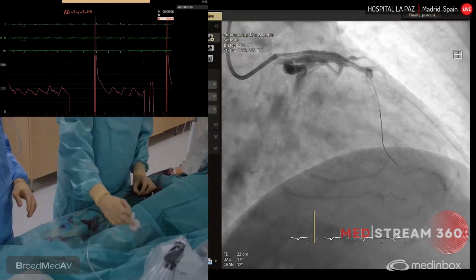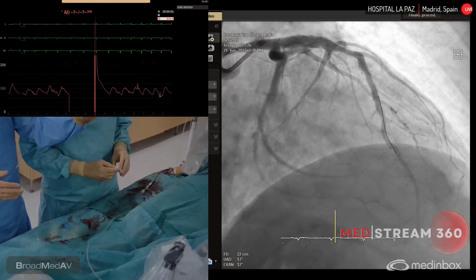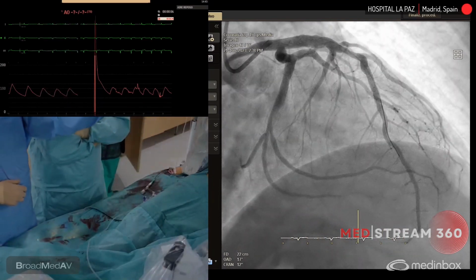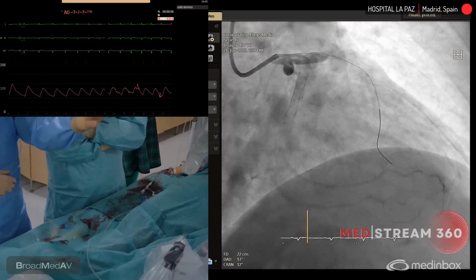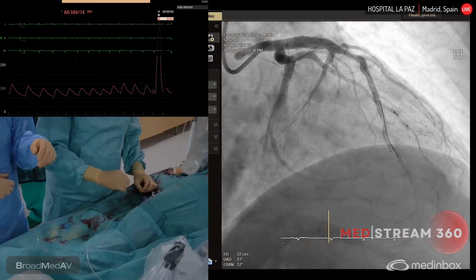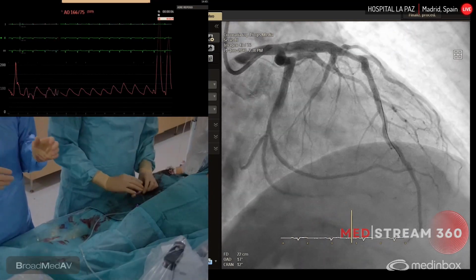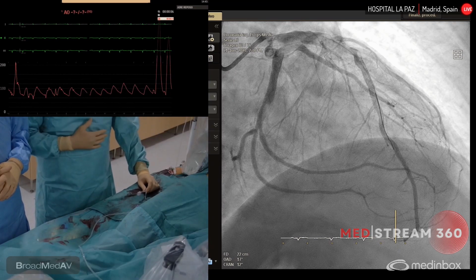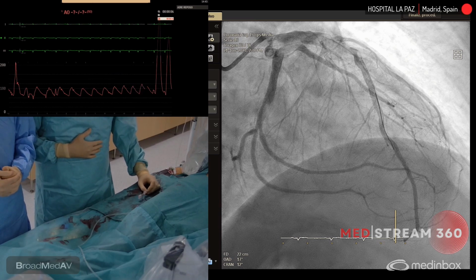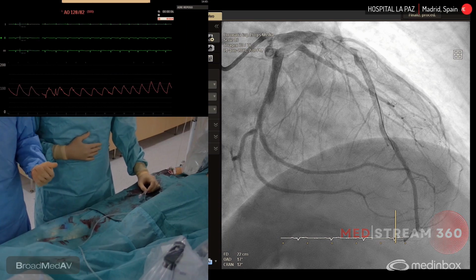Okay, very good result, I think. We have also the OCT confirmation. So very interesting case to recap everything. This stent thrombosis previously in the circumflex, with this haziness, we have reviewed with OCT, and we decided not to touch now. Probably we are going to review in a couple of months, leaving the antiplatelet treatment to do its job. And this non-culprit vulnerable plaque in the LAD has been randomized in the trial to the treatment arm, and we have implanted a stent guided by OCT with post-dilatation, and this good result.